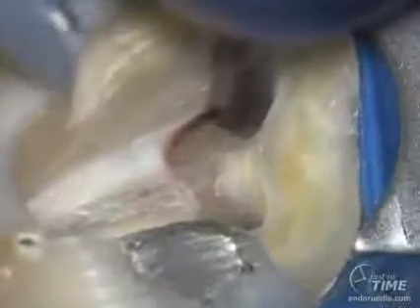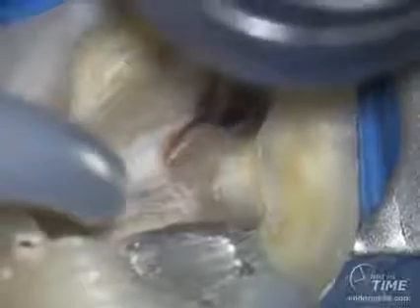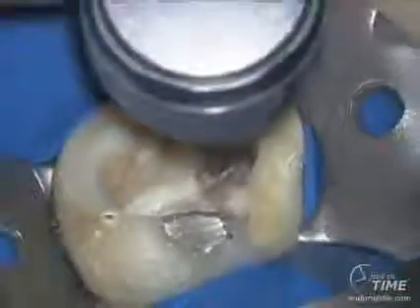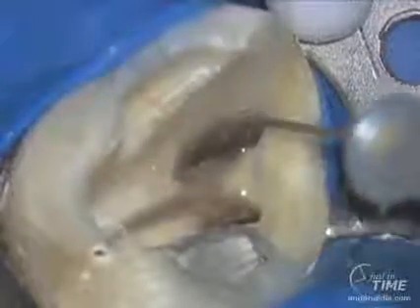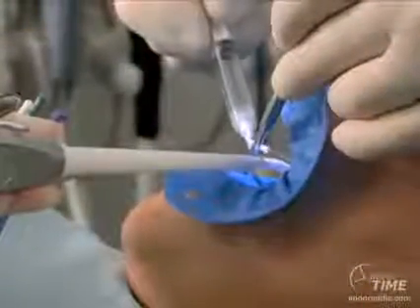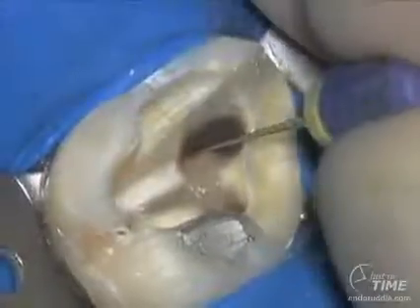So now we can just finish the access, and we can use the diamond with the Stropko. The Stropko is the item I identified earlier that can collimate air through the white mac in this case. We're using the surgical length diamond to flatten that axial wall and to improve access into the area of the MB2. We know that over 90% of all maxillary molars have two systems in their mesial buccal canals. So flushing is important, and after we've pre-flared the MB1, we need to start thinking about how can we expand and get into the MB2.